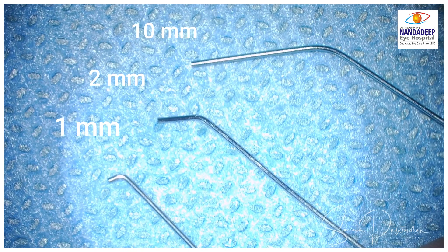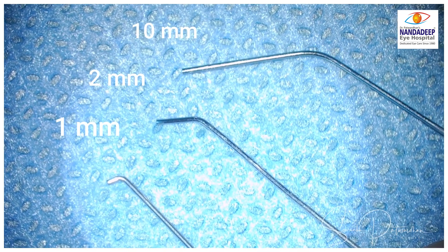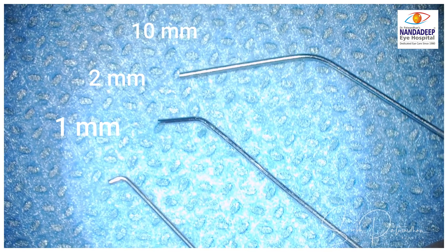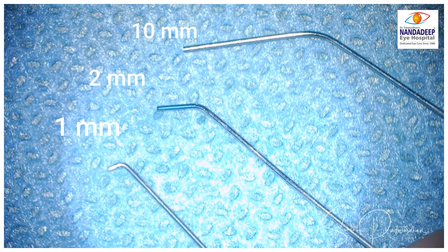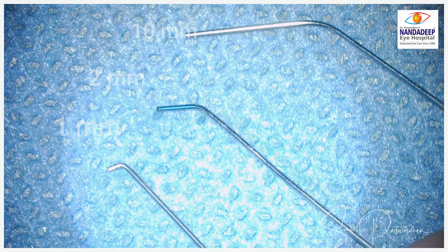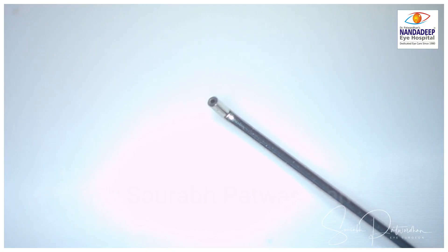These are the three types of hydro dissection cannula that I have. The 10 mm is the standard supply that we get. There is the 1 mm modified by Dr. Harshal Tak, of which he has gifted me a few that I have used in my cases. And there is a 2 mm one which I use in cases where I feel I need a bent cannula closer to the distal end.